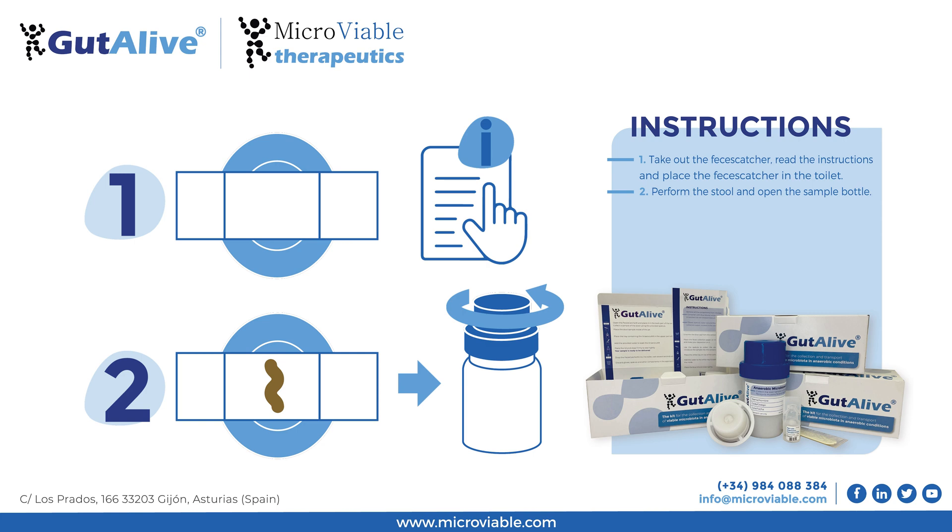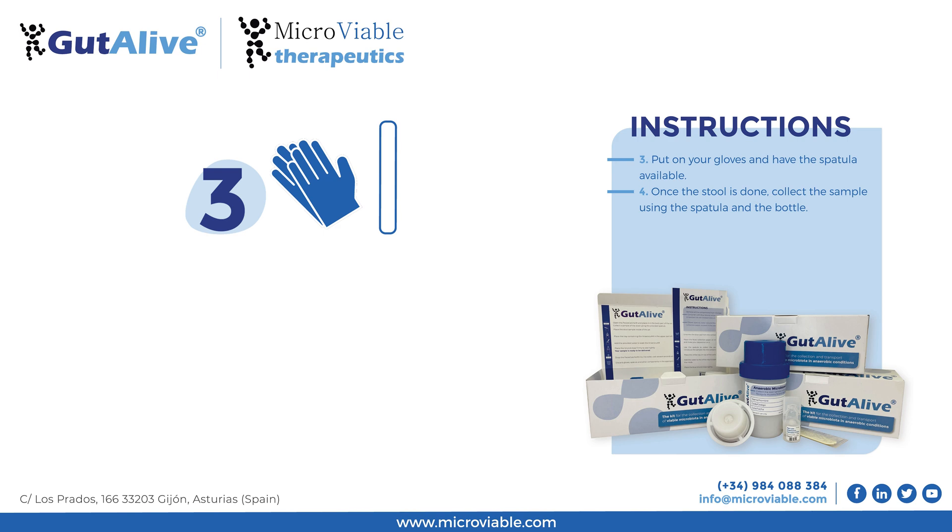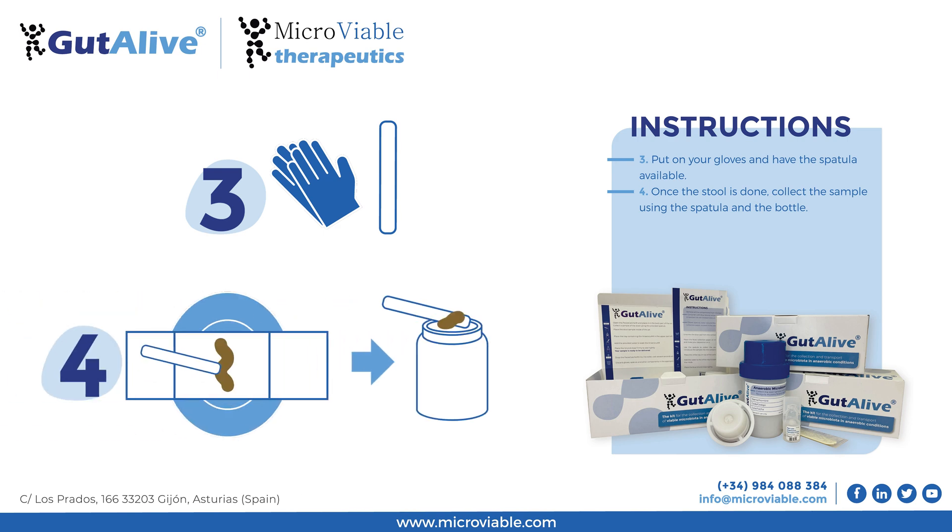Perform the stool sample and open the sample bottle. Put on the gloves and have the spatula available. After the deposition, collect the sample using the spatula and place it in the bottle.